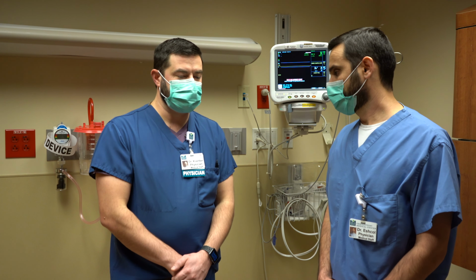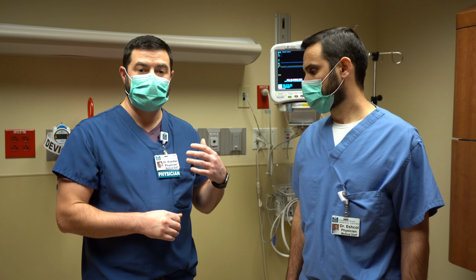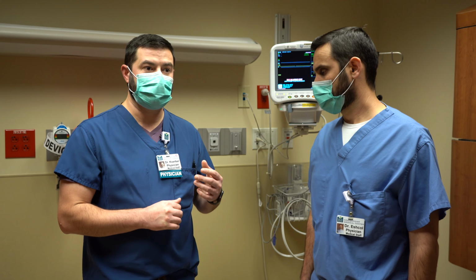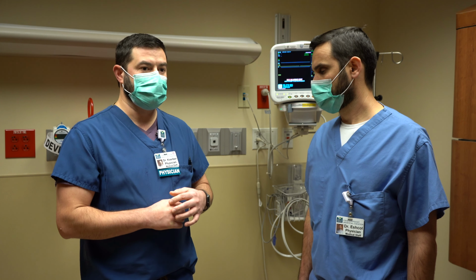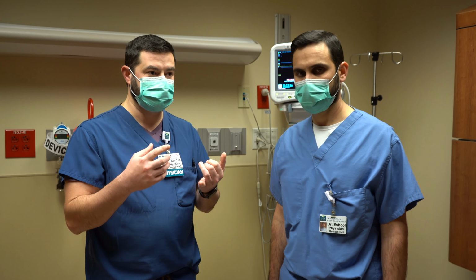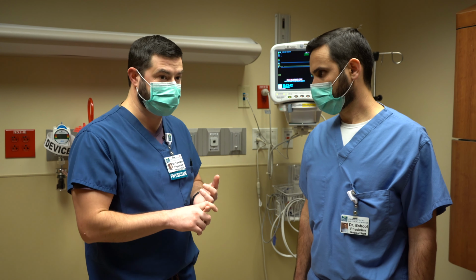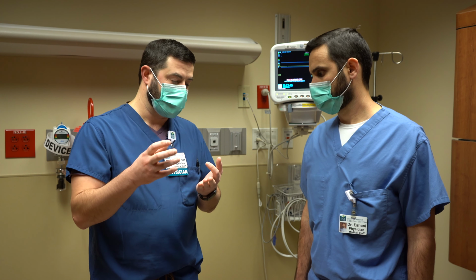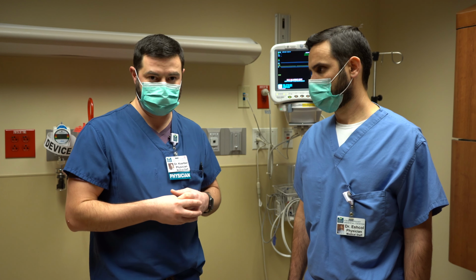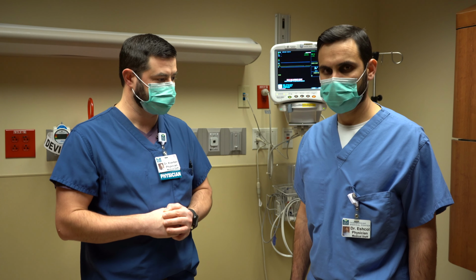Can you tell us a bit about any risks or benefits from this procedure compared to blood thinners? Yeah, like Dr. Eshcol was just saying, it's been studied in thousands of patients, and the risk and efficacy of the device has been shown to be non-inferior to blood thinners, particularly in those patients that can't tolerate blood thinners. Some patients in that category would be those with bleeding issues, such as GI tract bleeding, blood in your stools, patients with balance issues or frequent falls, or people with anemia or some problem requiring a blood transfusion. There's more that can be included, but those are the highlights.